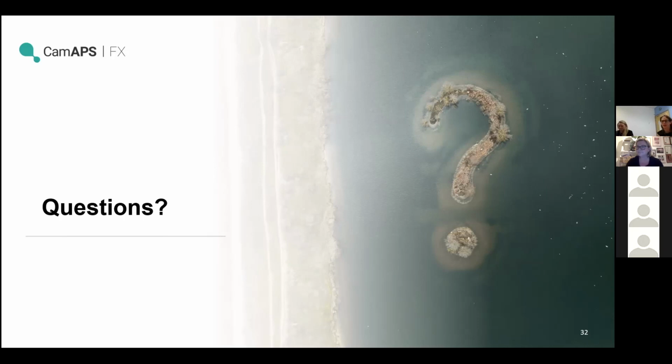we've done a little bit of training where people have gone onto everything in one go, and it probably does take about 2.5 hours, and that's quite a lot of information for somebody. If people are already on a sensor and, as Sarah says, already on a pump, that's very manageable, but otherwise you might find it easier to split it. It depends on the individual really, and your confidence in delivering the training.